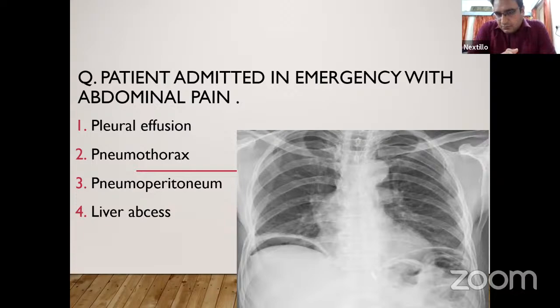We have to look for the lungs, we have to look for the bones, but I have told you, make a scheme. We have to look for the liver, we have to look for the gastric bubble also. Just think about it.